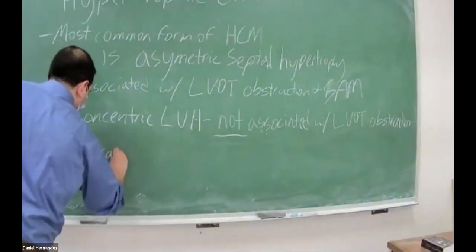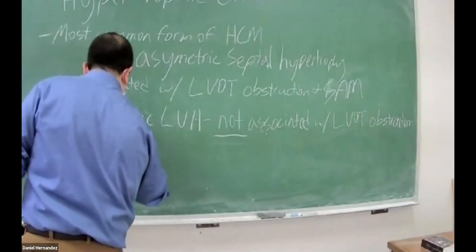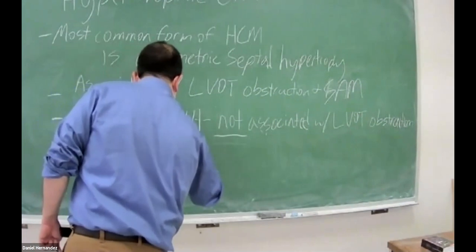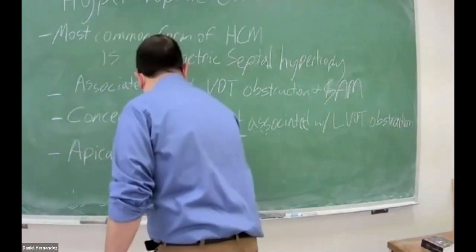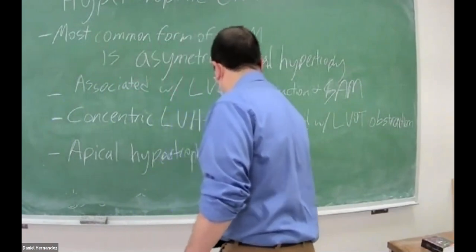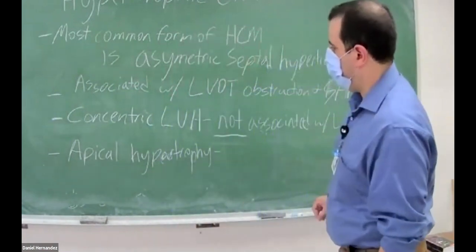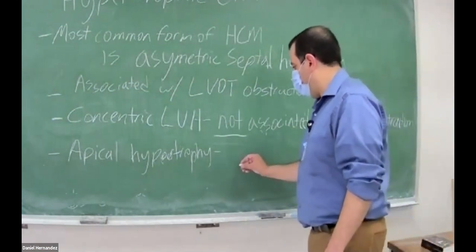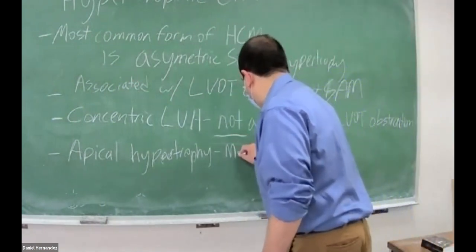Apical hypertrophy is more common amongst the Asian population.